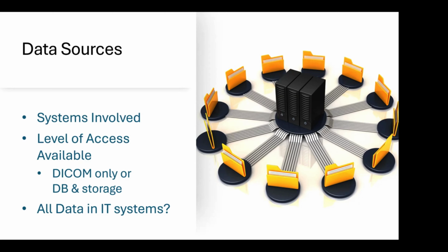But this is typically many times faster, and it also has a great reduction in the processing impact, and the database impact, and everything else on the legacy system. But it's not always available. It does depend that you can give storage connection to the data migration engine, and that the legacy PACS vendor will provide the database access.